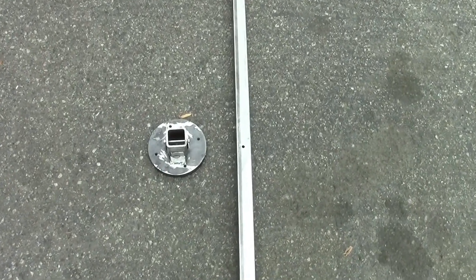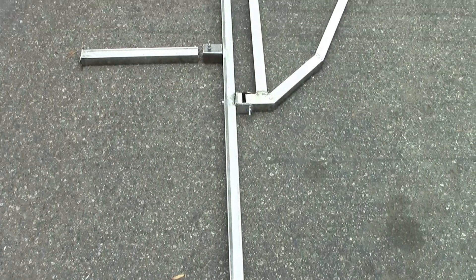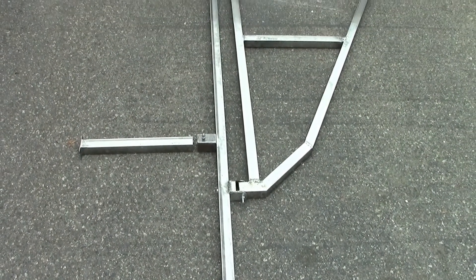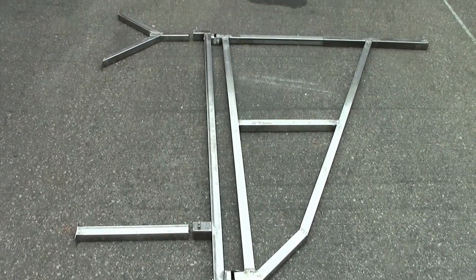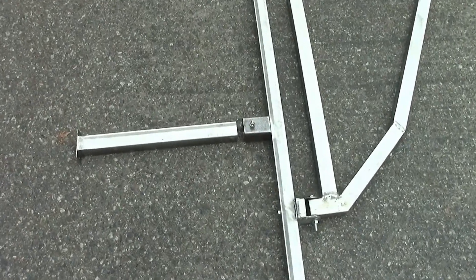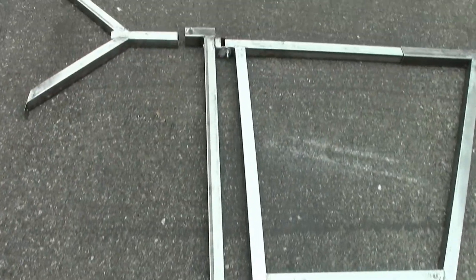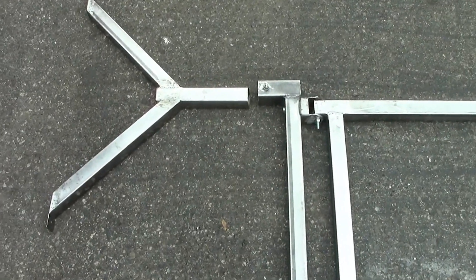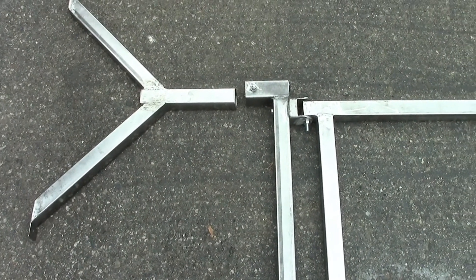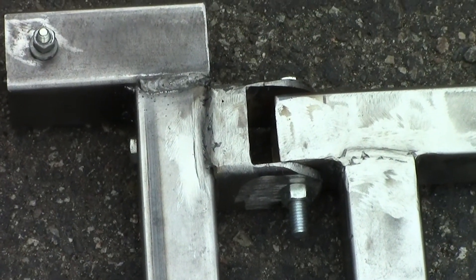Here we've got the unit laid out in the driveway. Here's the collar that sits on the wooden deck with a pin through it. You can see the braces on the back side. This is going to fasten right through the garage wall and help support the braces. This is a stabilizer at the top to keep it from swinging side to side. There's a good shot of the hinge.